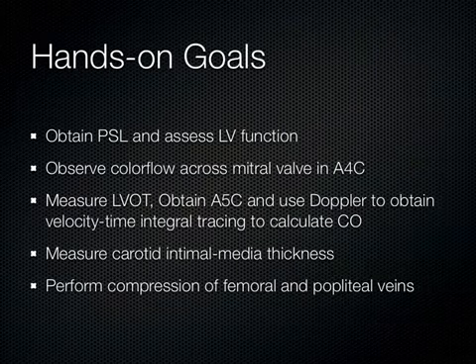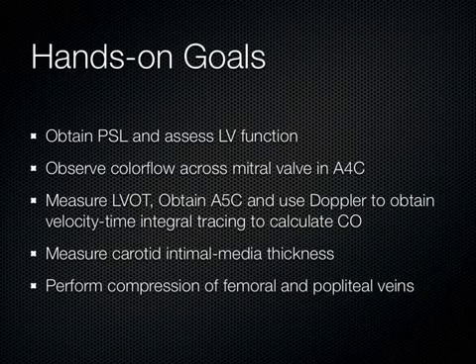Now, today in the hands-on session, I really want you guys to focus on that parasternal long axis and look at the overall LV function. Watch that anterior septal leaflet, that mitral valve, come up and smack the septum with each beat. And I want you to see that interventricular septum, the posterior wall, squeeze together. And then I want you to throw some color flow across that mitral valve in the apical 4-chamber view.